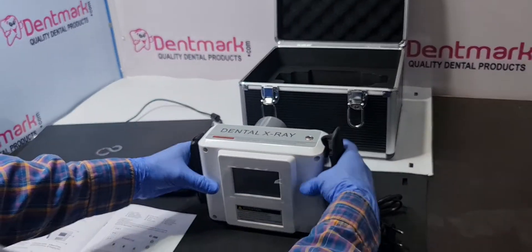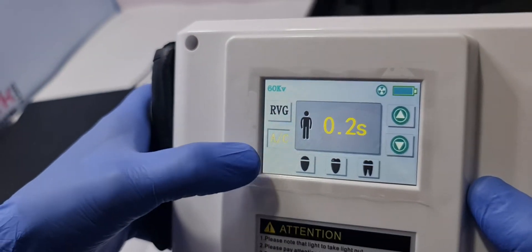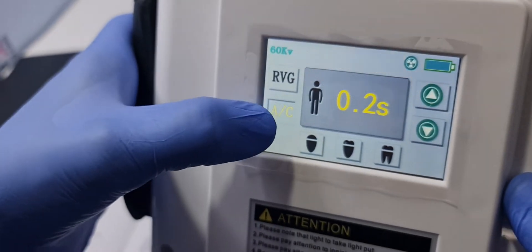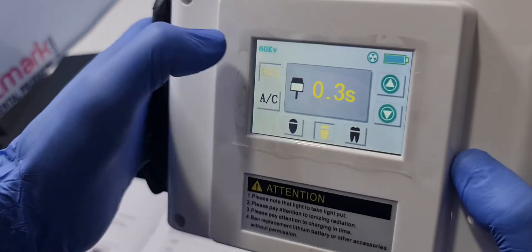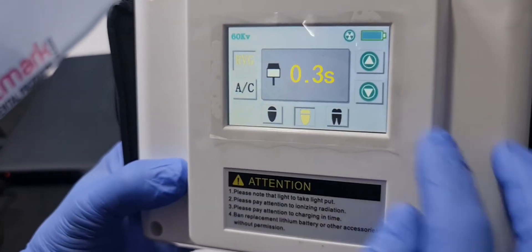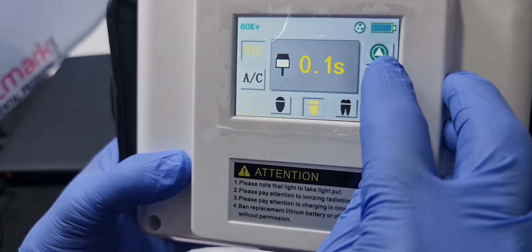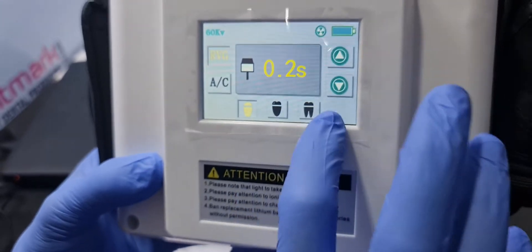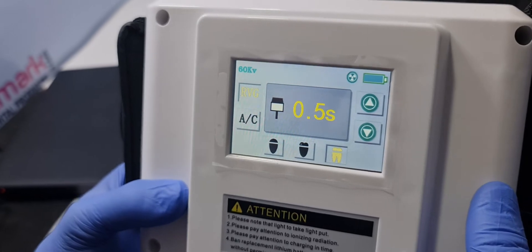It has a color screen with touch. You can see the settings: A for adult, C for child. If you want to use RVG, you can set the time from 0.1 second to 2.5 seconds. For interior, pre-molars, and molars, you can set the settings according to your need.